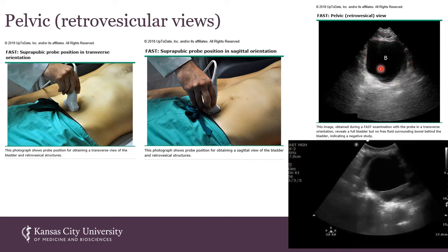And this incidentally is kind of where I look to see if somebody has urinary retention as well. So if I have, say, an elderly gentleman with BPH who comes in and is having issues, I'll take a look and see what his post-void volume is in his bladder to see if he's emptying all the way.